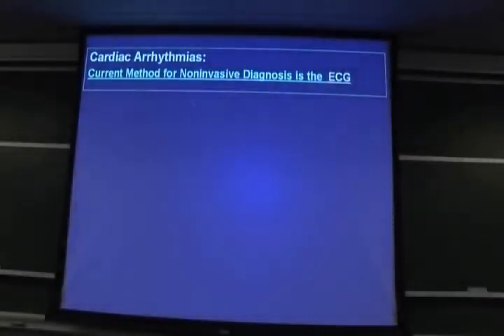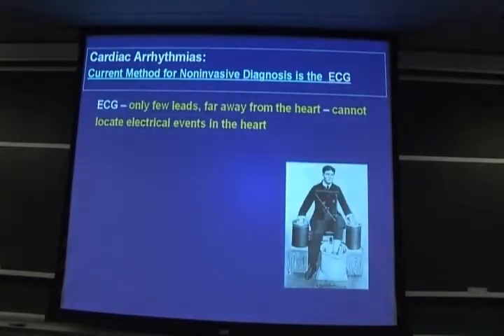And first of all, we all know that the current method of non-invasive diagnosis of cardiac arrhythmias is the ECG. And the ECG suffers from many limitations. It's been a fantastic tool and has really served the clinical community and cardiologists for many, many years now, over 104 years. I think it was 4 years ago, exactly when we celebrated 100 years of the ECG in the Netherlands, where it was invented by Einthoven.